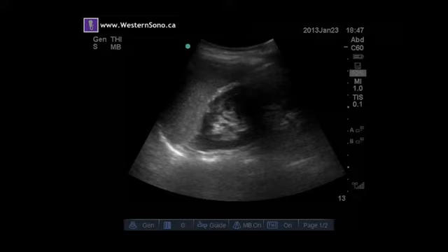Similarly, here is a view of the left upper quadrant. You can recognize the sonographic landmark of the double density of the kidney. Adjacent is the solid organ, in this case the spleen. The bright echogenic line between them is once again our area of interest, and on the left side is the splenorenal interface.